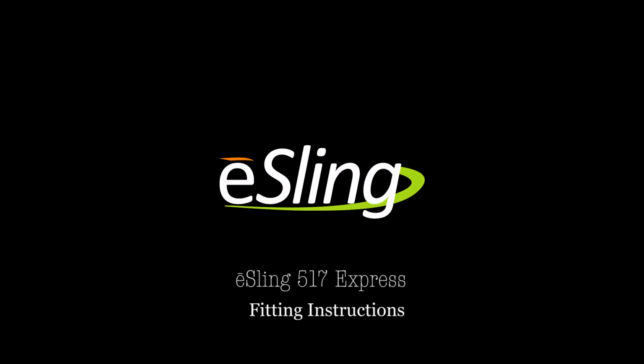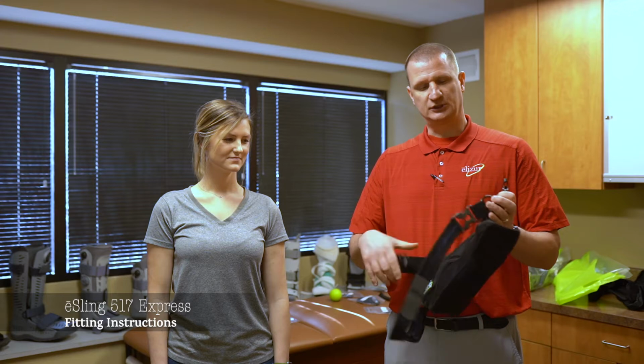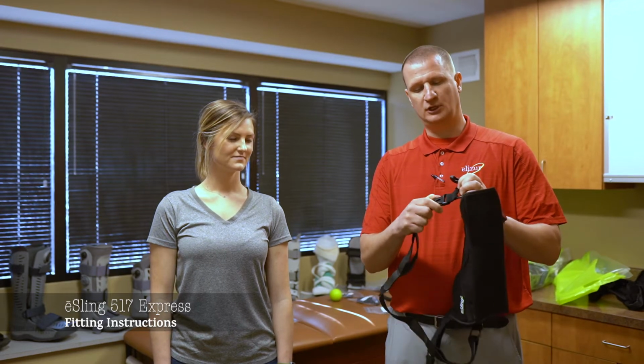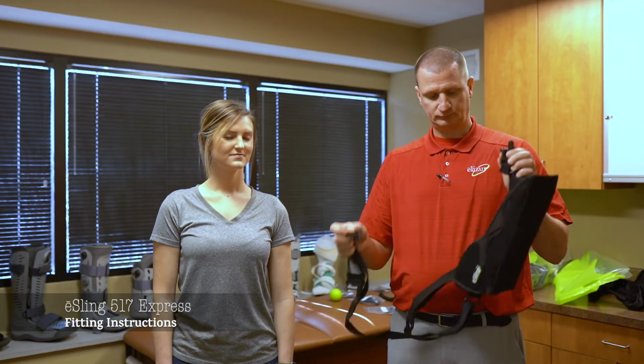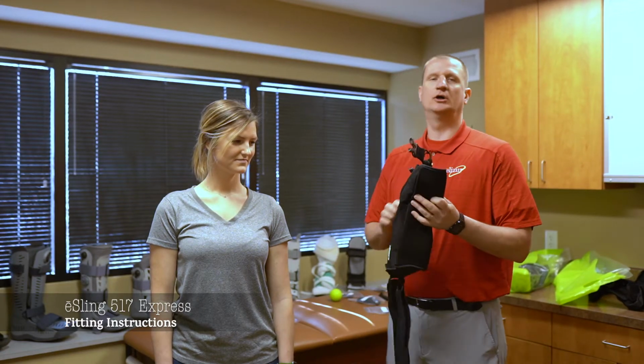We're going to start off with the eSling Express, okay, which is your basic sling, no pillow, right? No torso mount. Okay, but it does come with the waist strap. So we'll show you how to utilize the crossbody strap and the waist strap. What you're basically going to do is just unhook the sling, the waist strap, and the crossbody strap. In this case, we're going to do the patient's left arm.